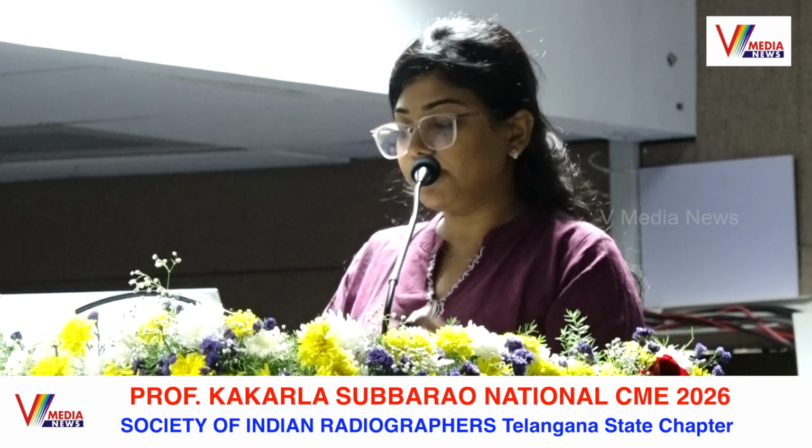In monophasic we use only contrast. In biphasic we use contrast and after that a saline chaser. In triphasic there are 3 steps: in the first step we use contrast, the second is a mixture of contrast and saline, and the third is only saline. It is the advanced one, but we are using the standard one, that is biphasic.